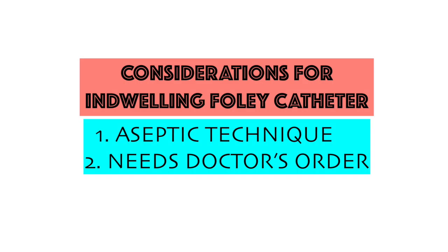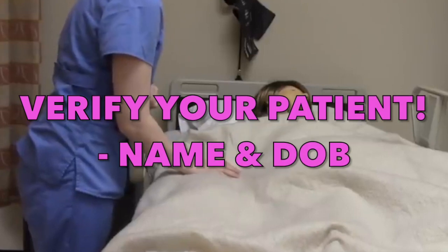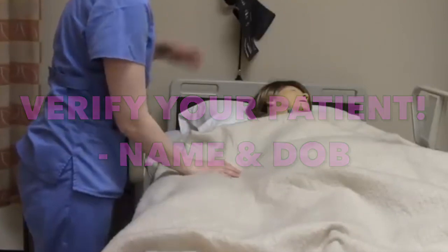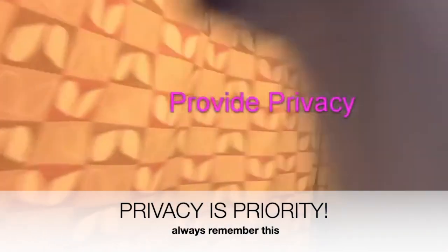To start, considerations in inserting a foley catheter: it should be done with aseptic technique and with a doctor's order. Hand washing — do not forget this. And verify your patient's name and date of birth. It is also important to maintain privacy for your patients.